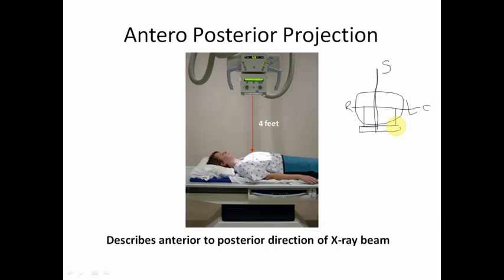So after that, what are the next steps? Patient positioning over, part positioning over. Patient positioning means the patient will lie down in supine positioning, and we ask the patient to keep both hands aside. Then part positioning, the mid sagittal plane will be perpendicular. Then the cassette will be placed. You can see here, this is the digital radiography bucky. This is the upper border of the cassette, this is the lower border of the cassette.